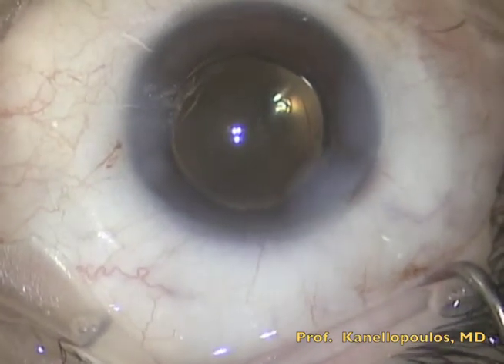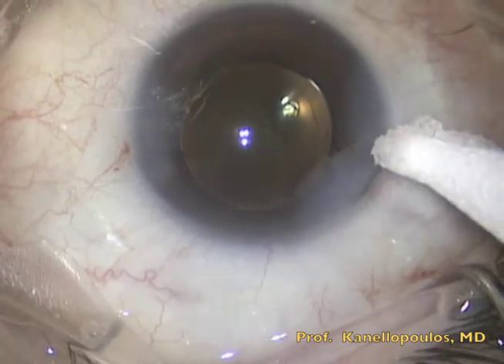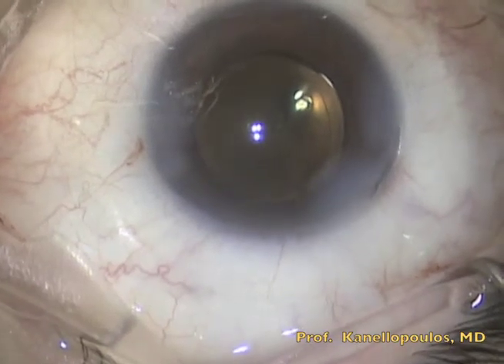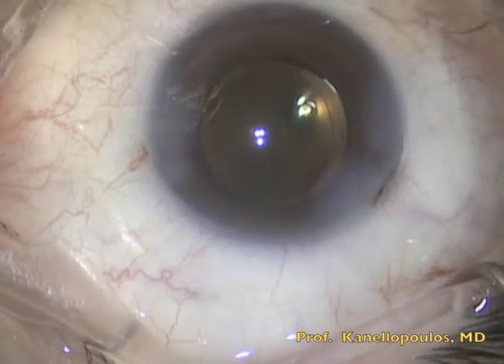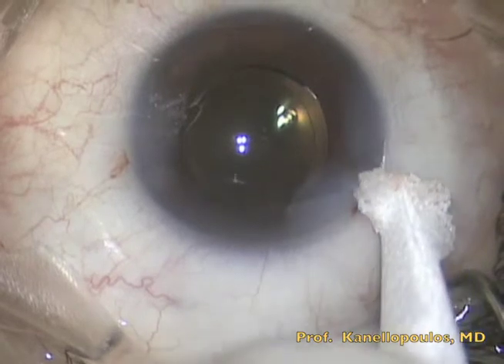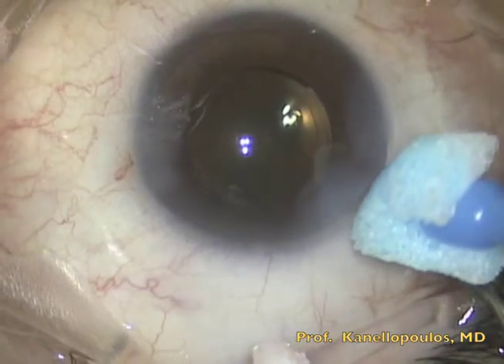As you can see here, there is no leakage. We then go and mix the ocular bandage. Resure has a bluish color once it is mixed, and it is applied right at the dried incision with a sponge.